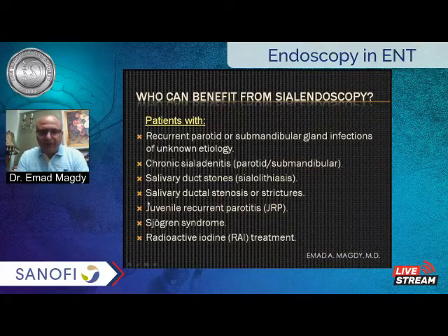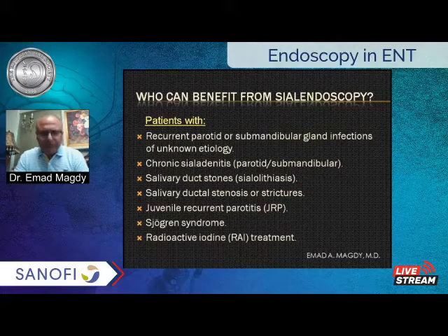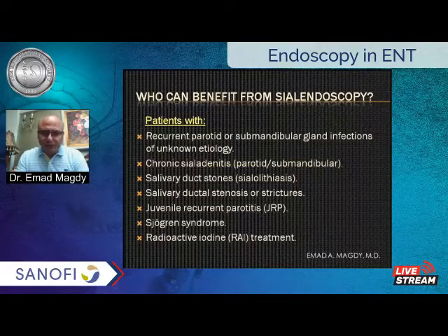Recently, we've been using sialendoscopy in some other indications like juvenile recurrent parotitis, Sjögren's syndrome, and radioactive iodine treatment, and we've been having some very good results in these difficult to treat cases by actually clearing the ducts by irrigation and instillation of corticosteroids, and this got marvelous results in these difficult to treat patients.